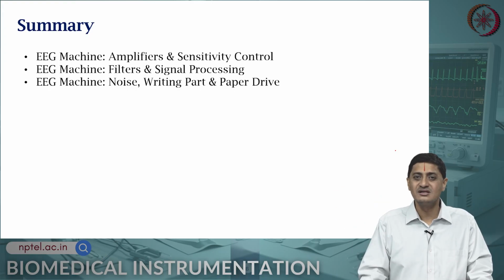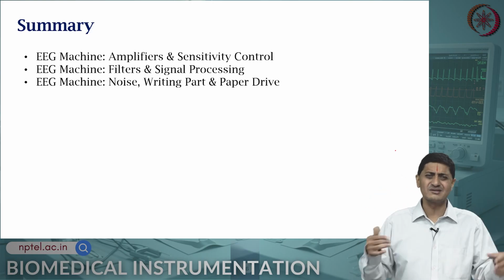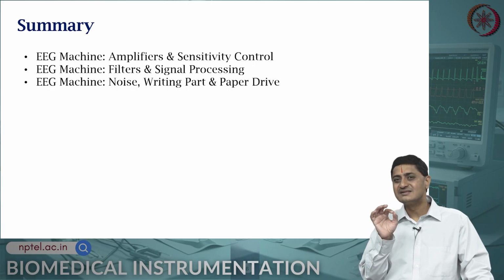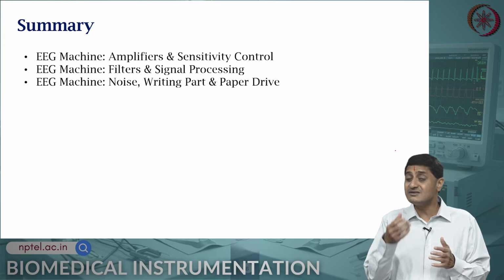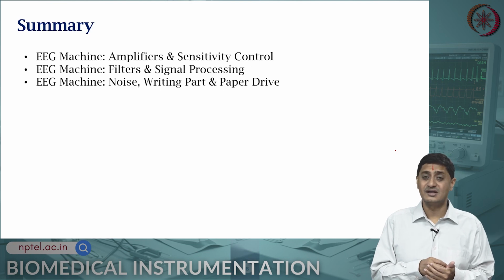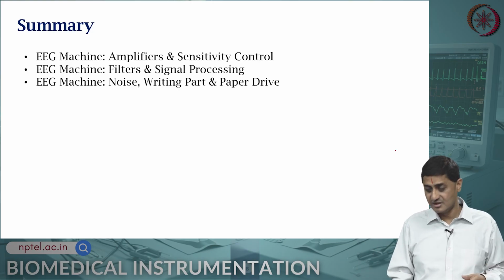It is a crowded stadium, people are always talking, right. So, I need a sensitive microphone, a high gain amplifier and noise cancelling technique. All of these are required for me.